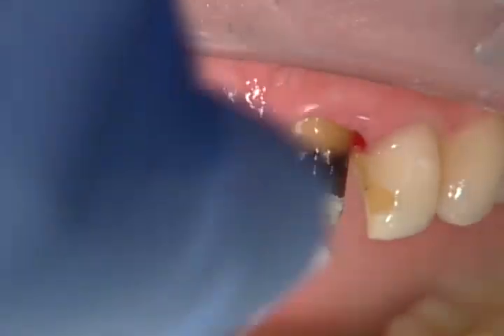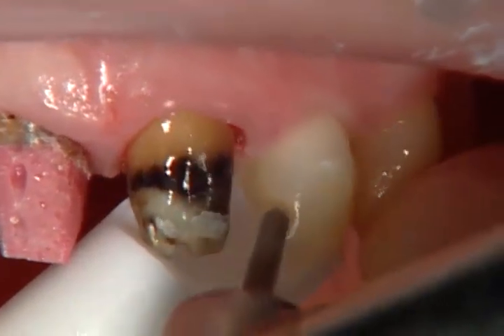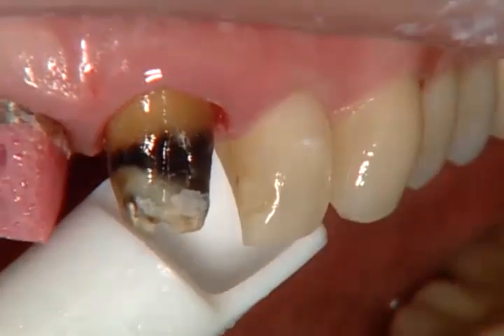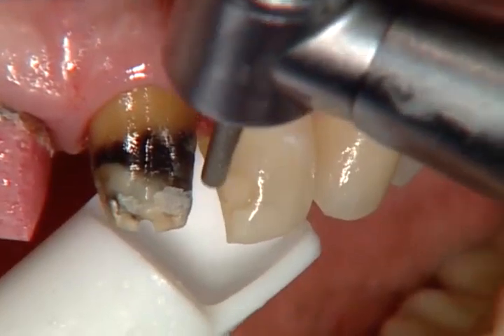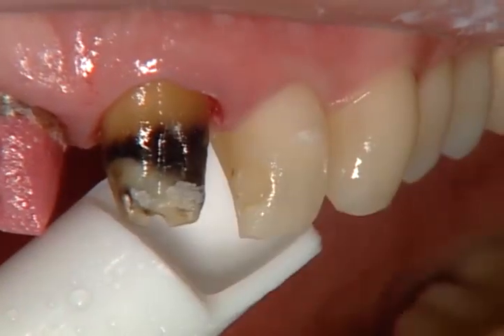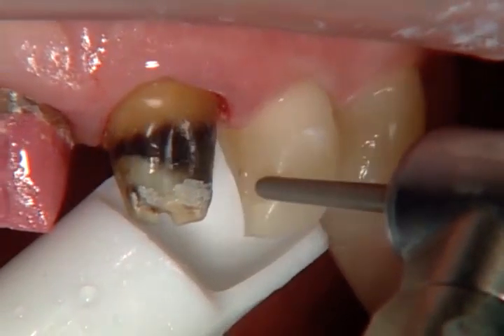So you can tell both of these teeth have had endodontic treatment. One's got the pink buildup material, and the tooth next to it, tooth number 9, has the discoloration you would expect. I'm going to replace this little composite here on the mesial of tooth number 10 because I noticed when I looked at her smile before I could see it. There's clinically nothing wrong with the composite. It was just kind of obvious.